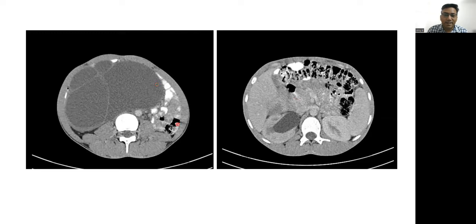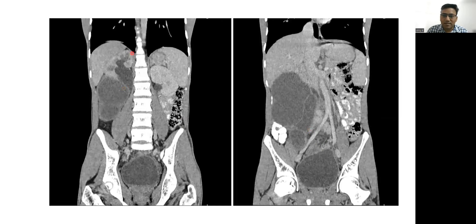This is the contrast-enhanced study which shows mild enhancement of the septa and better depiction of the right-sided hydronephrosis. On the coronal section, apart from the mass effect on the right proximal ureter, there is also mass effect on the major abdominal vessels. The abdominal aorta is displaced to the left side, and there is abutment of the right side of the common iliac artery.